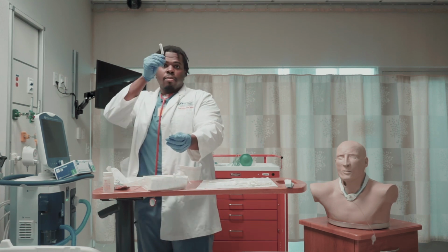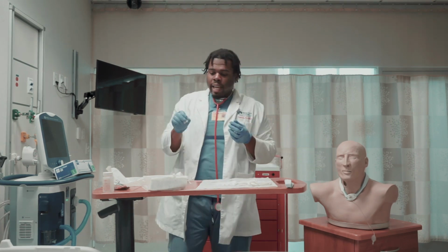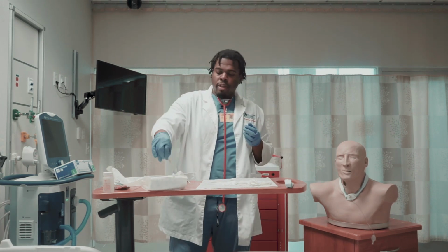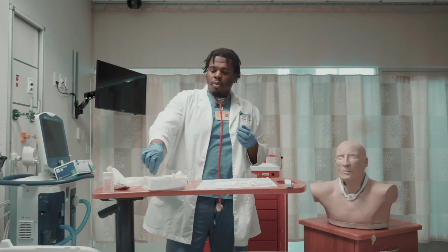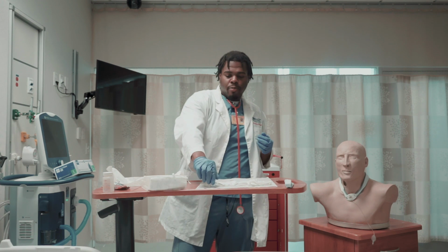Now that I've cleaned that, I'm going to dispose of this and rinse the inner cannula in water. Shake it off. Water. Shake it off. I'm going to put it to the side to dry.